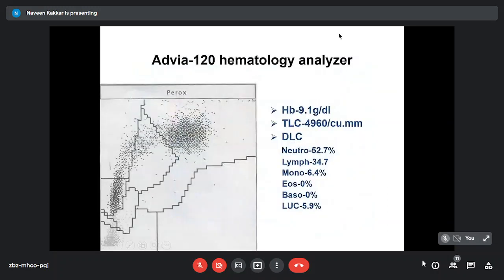So this now takes you to the Advia 120 analyzer, the 5-part scatter plots there. This is a normal one. I'll just show you what the zones are. That's neutrophils in this zone, lymphocytes, large unstained cells, monocytes here, eosinophils here. Large unstained cells mean cells which are large and not stained by myeloperoxidase, because this is based on myeloperoxidase activity. Neutrophils have a high side scatter, so they will be plotted here. Lymphocytes have more forward scatter, not side scatter, so they are there.